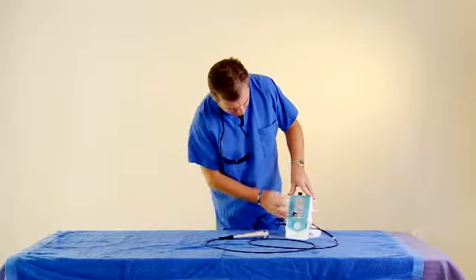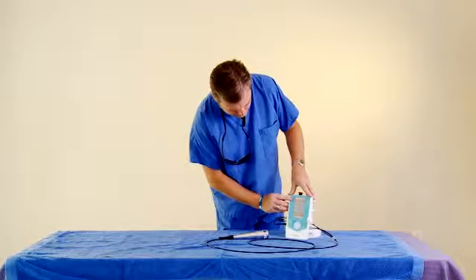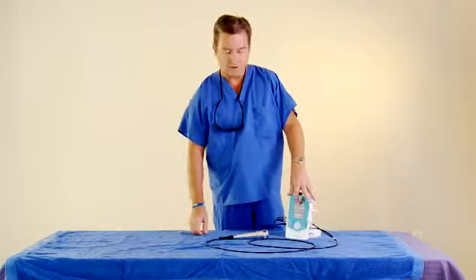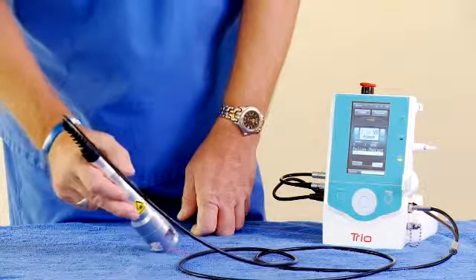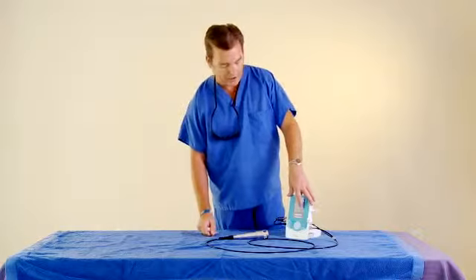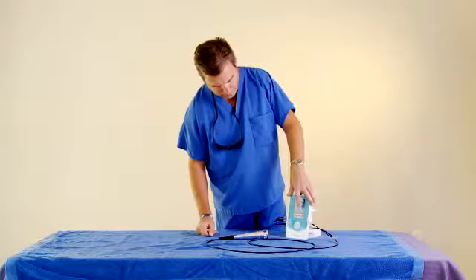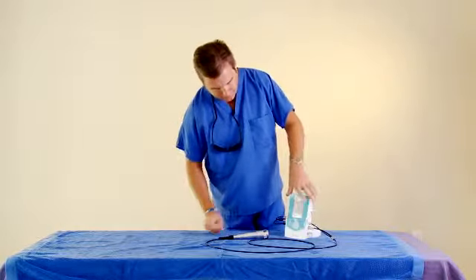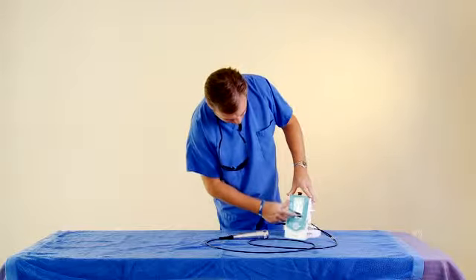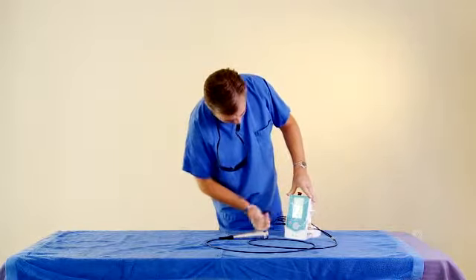You can go back. In the options key, you can do settings. This is where you can set the brightness of your pilot laser, which is the red light. You can set the sound level for your beeps. If you have an anxious patient, you can turn down the sound totally. And then the backlight of the screen. And you can also turn your timer on or off.